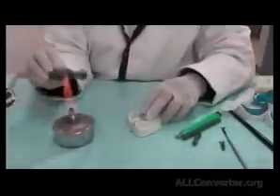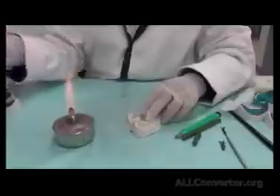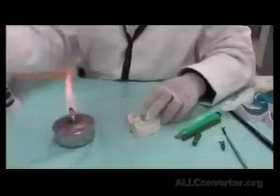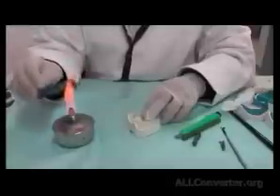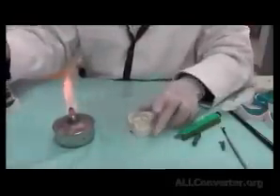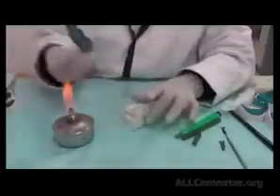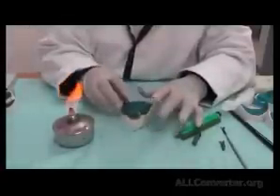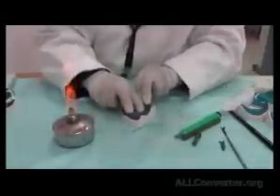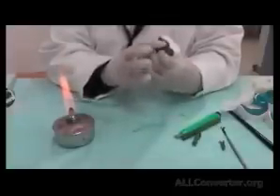I warm it once more. Now because it's a bulk, I need to temper it for a longer period of time. I'm tempering it twice or 3 times until I'm sure that the material is flowable enough. And once ready, I cool it down in the warm water. I go into the patient's mouth and I press vertically first. And with my fingers, I could also go into the patient's mouth and further press this area towards the tissue.